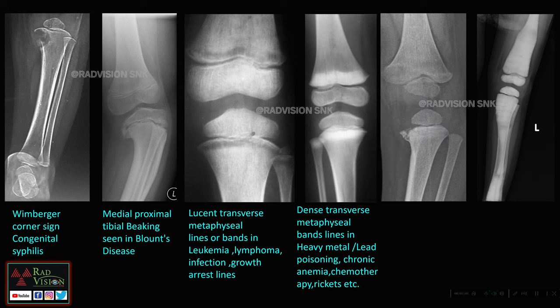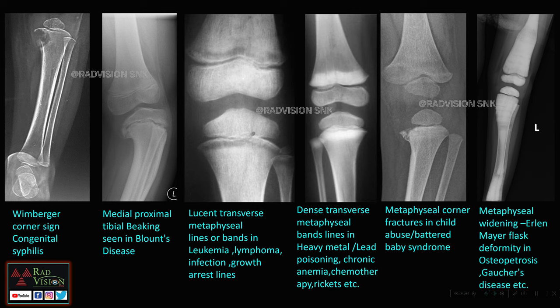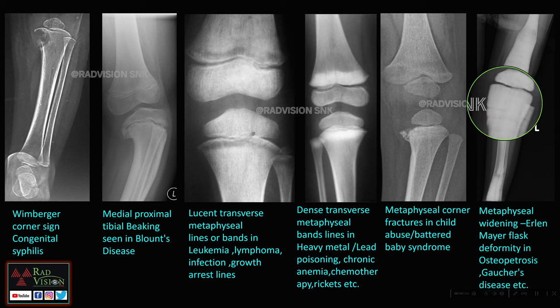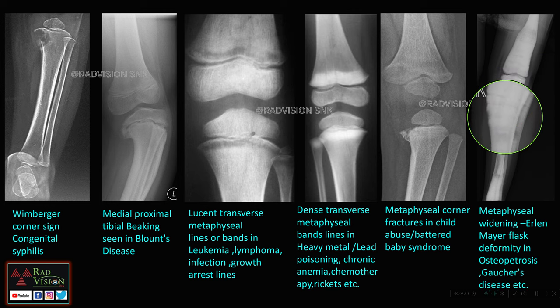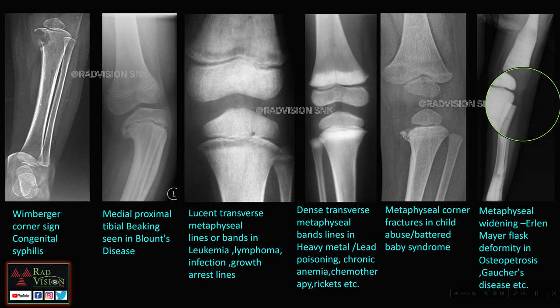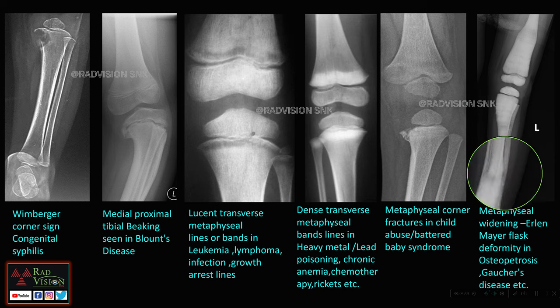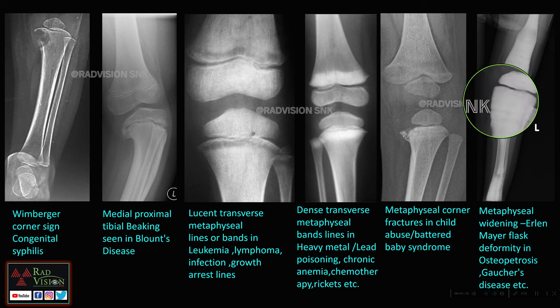If there are fractures of the posterior ends of the ribs along with a suspicious history in a child, definitely suspect child abuse or battered baby syndrome. Here you can see metaphyseal widening with growth arrest lines, classically seen in osteopetrosis. This is the Erlenmeyer flask deformity, which can also be seen in osteopetrosis or Gaucher's disease.